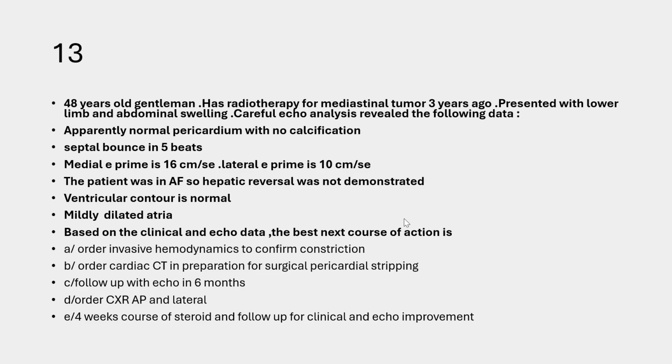Okay, let's take this question. A 48-year-old gentleman had radiotherapy for a mediastinal tumor 3 years ago. Presented with lower limb and abdominal swelling. Careful echo analysis revealed the following data. Apparently normal pericardium with no calcification. Septal bounce in 5 beats. Medial E prime is 16 and lateral E prime is 10.